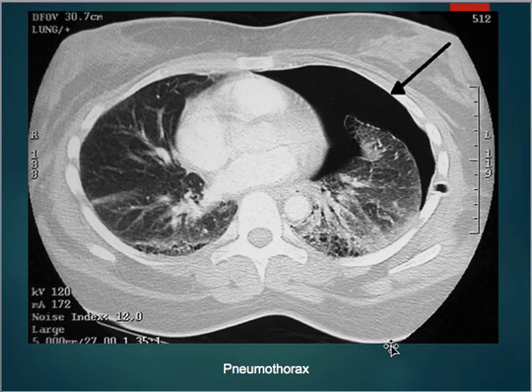This is a pneumothorax. Do you guys remember what a pneumothorax is? It's a collapsed lung. So here on the right side of the patient, you can see that the lung is filling that entire thorax from front to back. But here, what happens is you've got the lung tissue that's actually pulled away from the side of the thorax. So all of this right here is where the lung field should be, but it's pulled away and almost shriveled up.